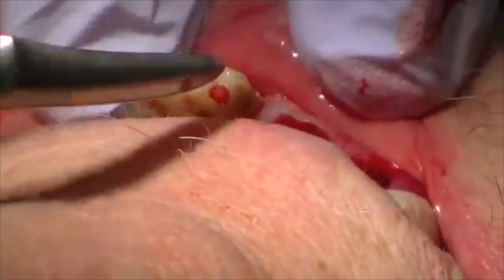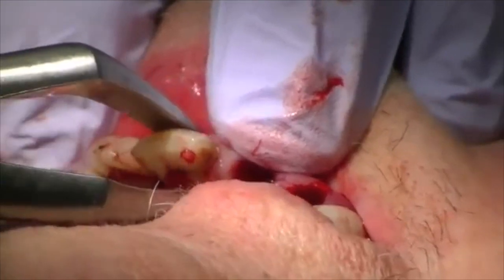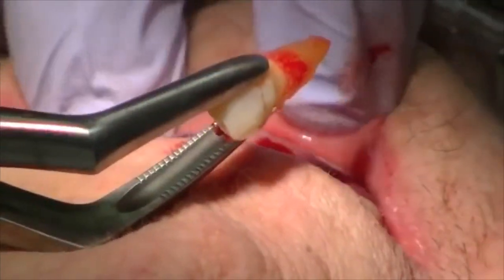Going back to my tooth delivery instrument. And again, these are big composite fillings here that we want to be a little bit careful with. And you can see the facial plate — again, it's totally intact.